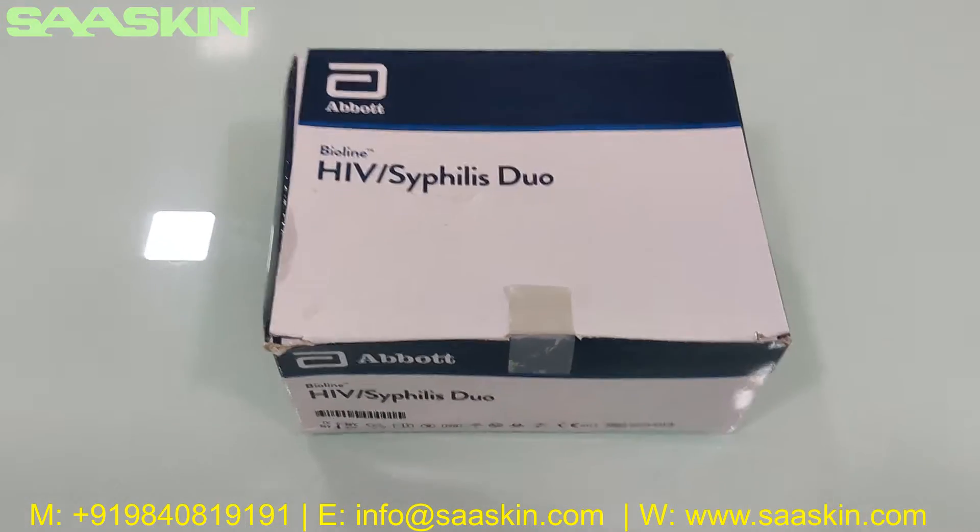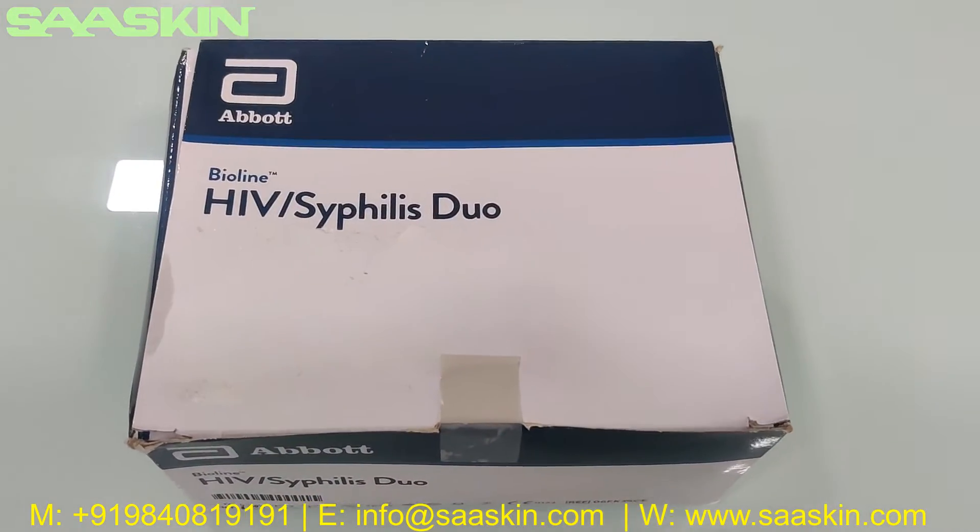Hello everybody, today we are going to see the unboxing of the Abbott Bioline HIV Syphilis Duo Test Kit.